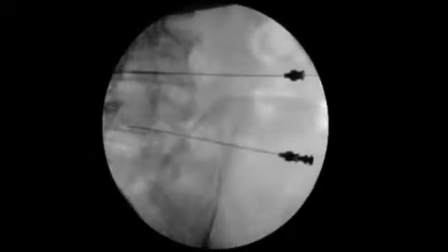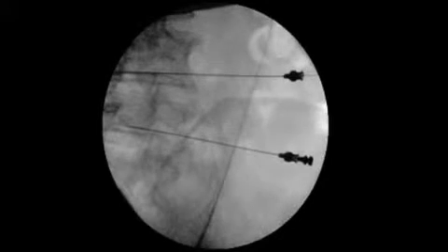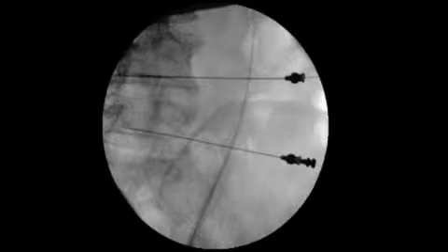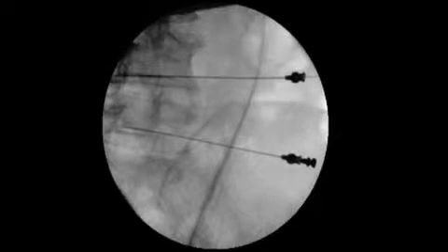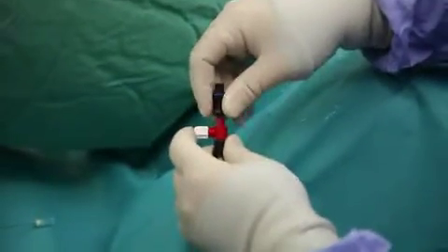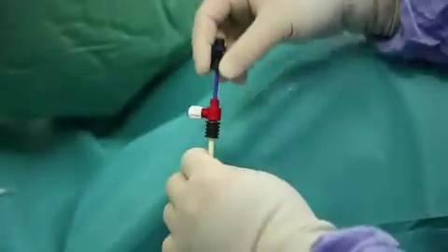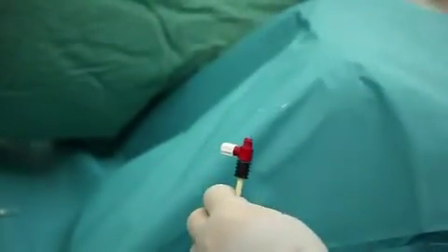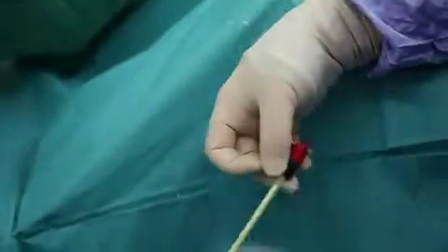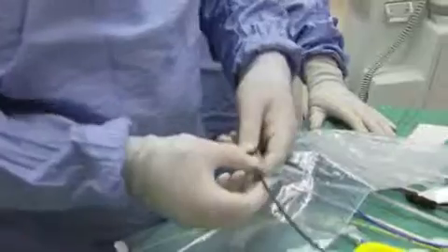This is all done under image intensifying guidance. You can see the sheath progressing above the proximal end and the distal end. And now I'm removing the inner part of that sheath, and this is very important. As you can see here, the sheath is coming out, and you can see the urine coming out from the ureter. This step is very important because you know that you are in the right position.